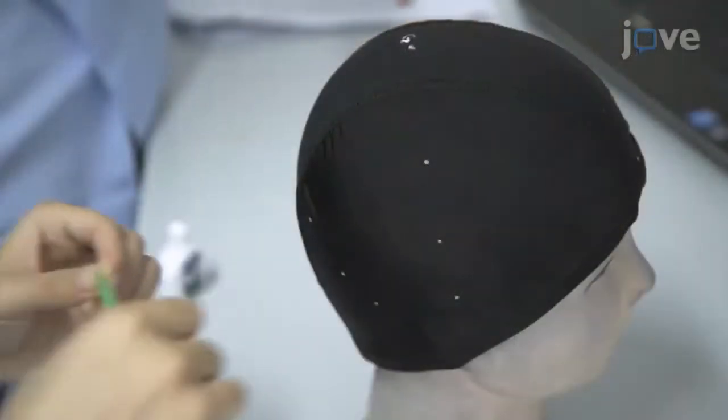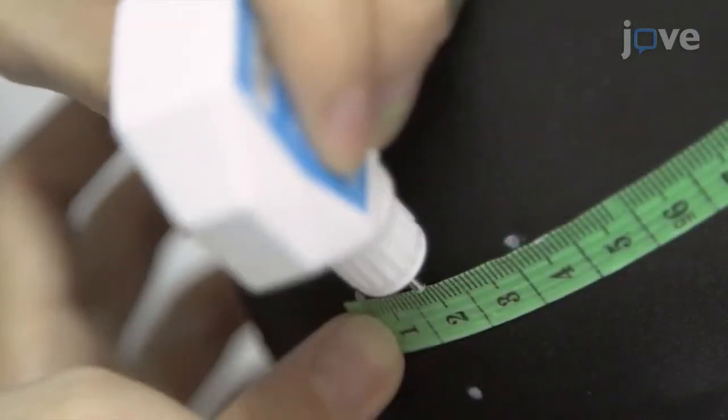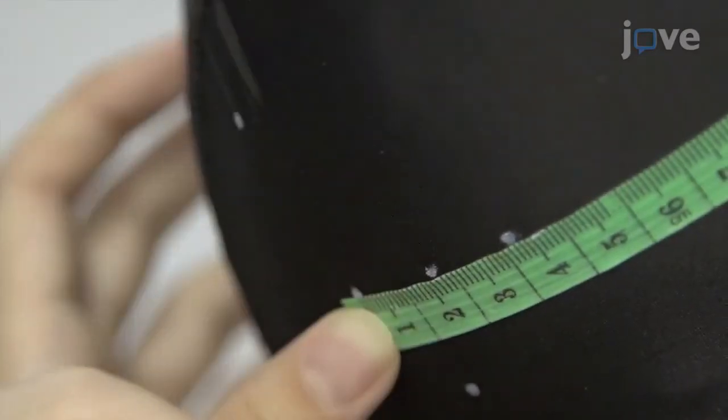According to the 10-10 system, find CP6 and P6 and mark the appropriate midpoint at which these points intersect, called the right temporoparietal junction, on the scalp.